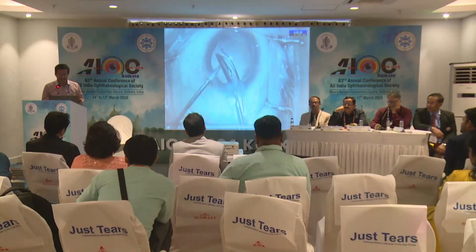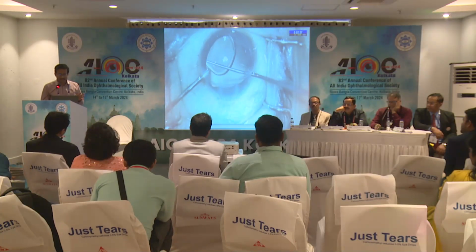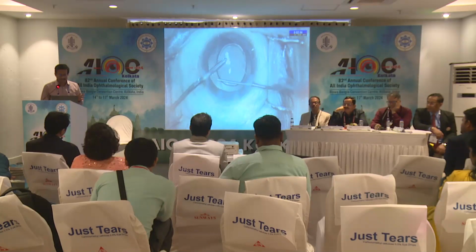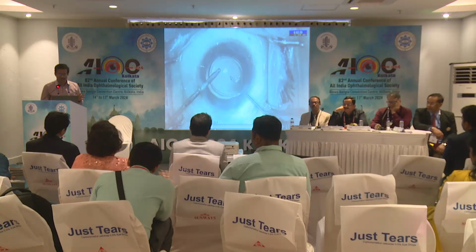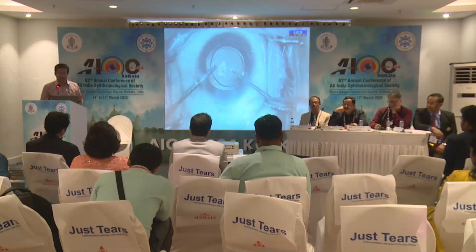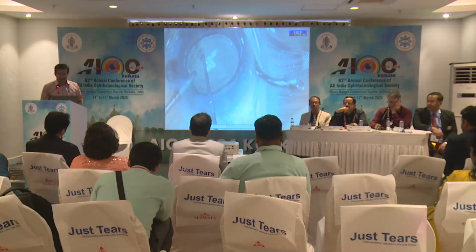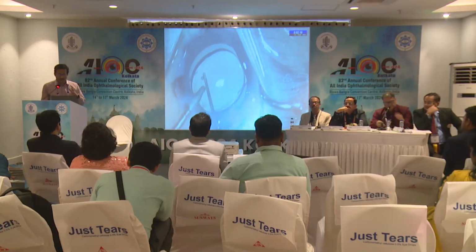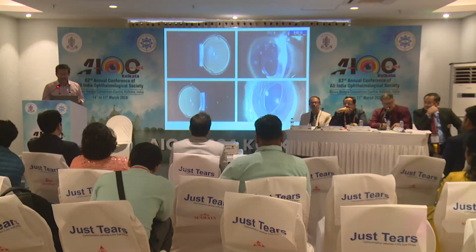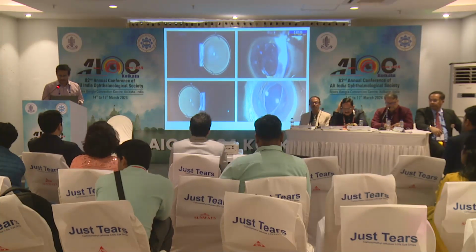A multipiece lens: the first haptic goes into the sulcus, in front of the optic, in front of the rhexis. The second haptic also goes into the sulcus. Thereafter, the optic is nudged so that the optic edges are below the rhexis margin. So you nudge, so the square edge of the optic does not cause iris chafing. In the immediate postoperative period, you can see the haptic is out of the bag in the sulcus, and the optic is covered by the rhexis. This is how it looks.